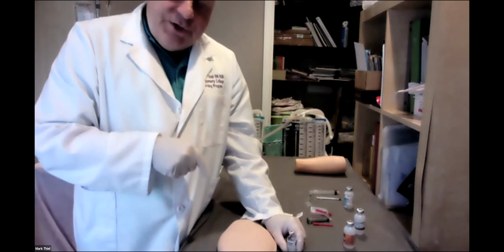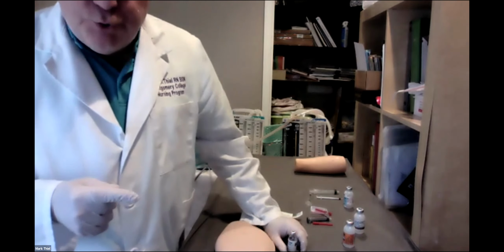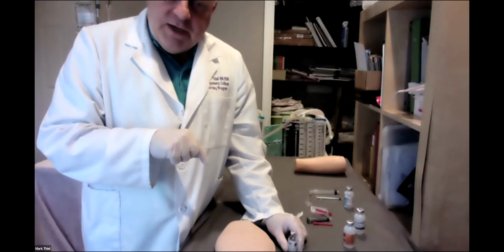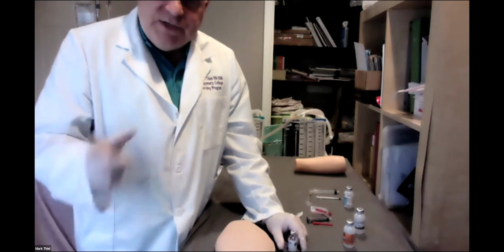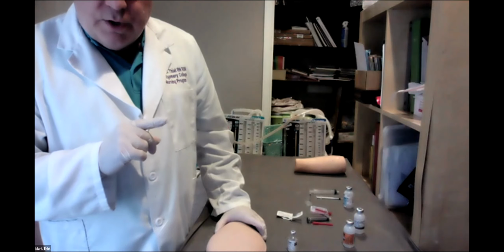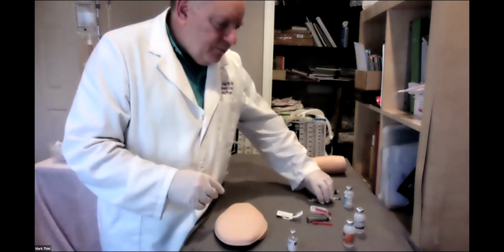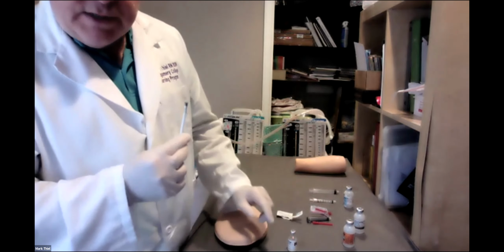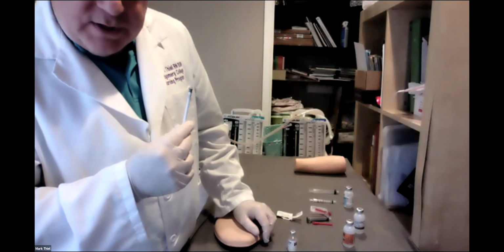Before I would inject insulin, of note, real world nursing, what do I have? That tray in the room, the breakfast tray, lunch, the meal tray, etc. It's in the room so that we don't wind up with somebody going hypoglycemic on us, if that occurs, rather, I should say. Right. We discussed the insulin syringe. You can't see it very easily, but it's designated in, once again, what? Units.